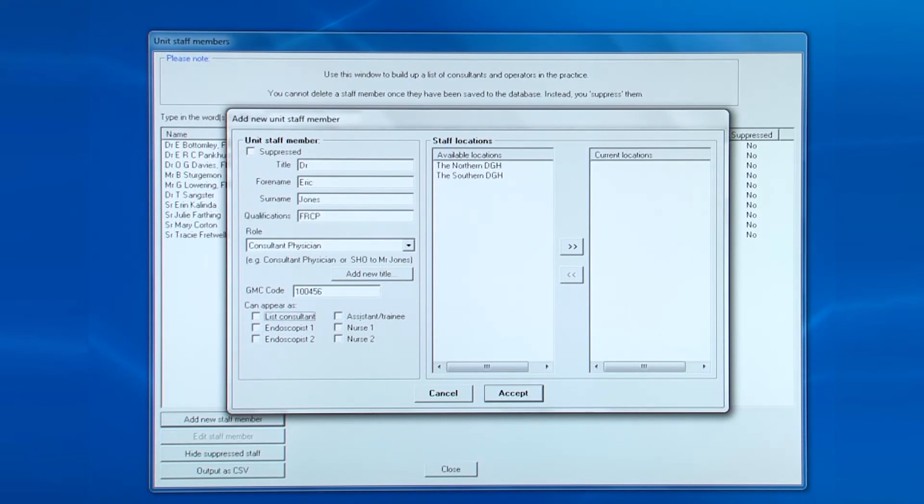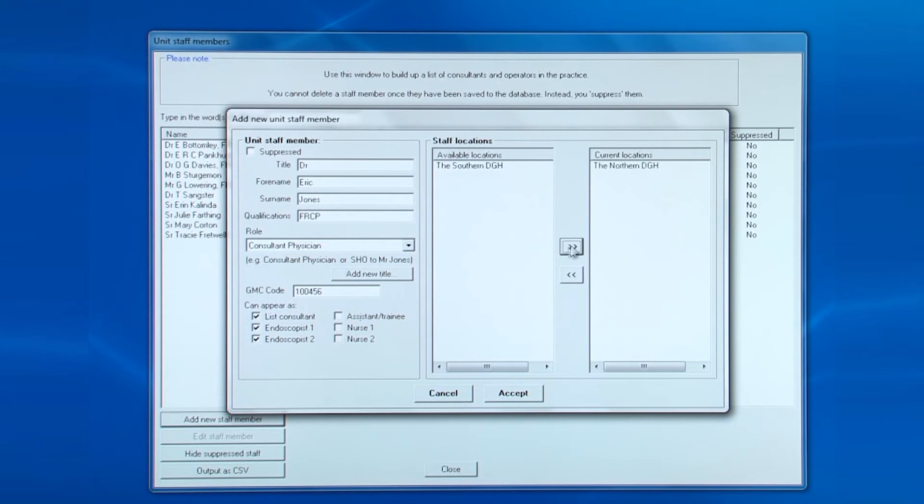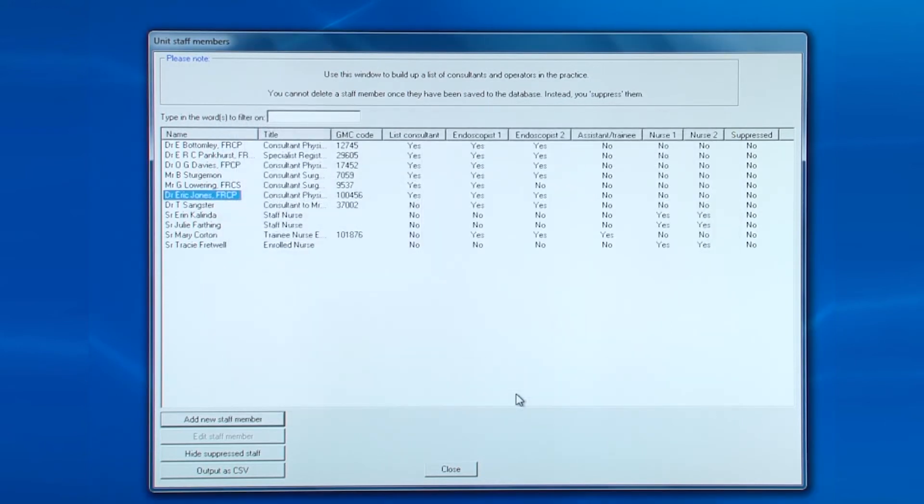In this example, because the database covers more than one hospital, you need to select the appropriate location for the staff member. Then click accept. The new staff member is added.